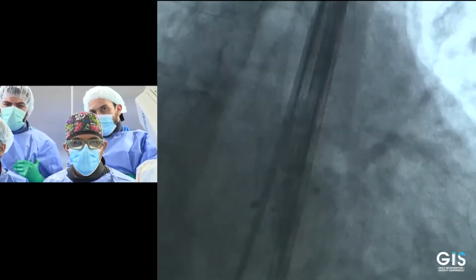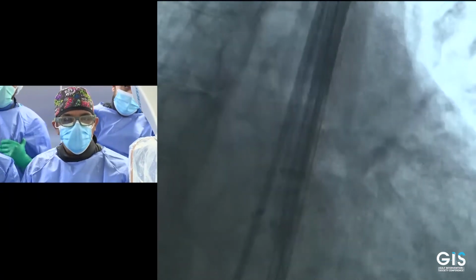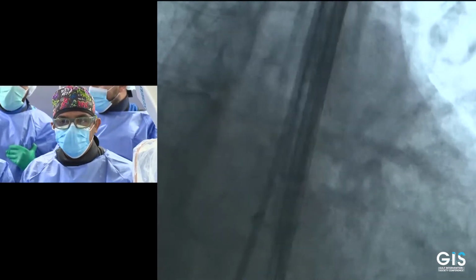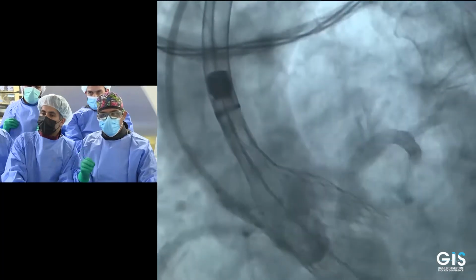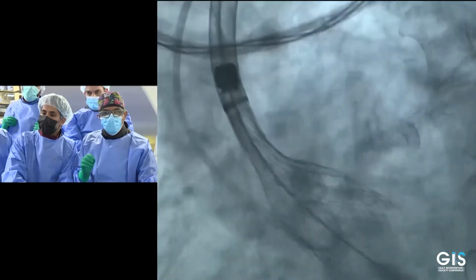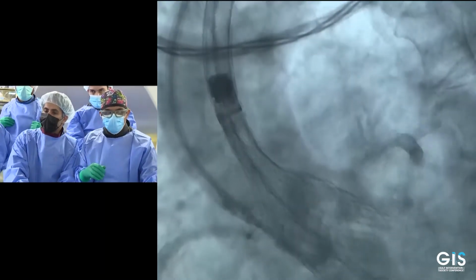As you can see on the screen here, the valve is positioned in this way. It's not our conventional way of seeing the valve, but we have closed our parallax in this view, and we will start deploying in this angle, which is RAO 35, 36, caudal 42 now. Despite that we are a bit low, given that we have a stent at the ostium of the coronary artery, extended on the left main, we would tolerate a little bit of a low position in order to increase the space for the sinuses to have a good flow into them.